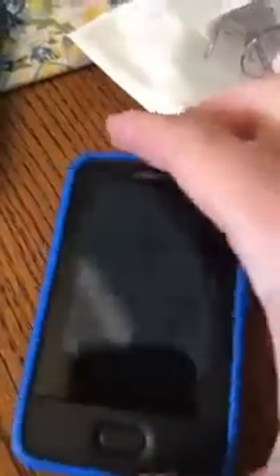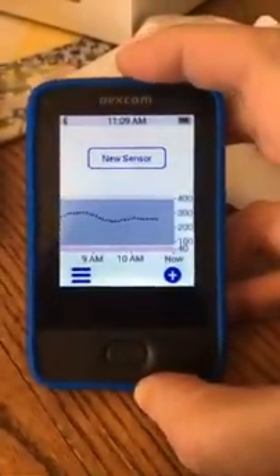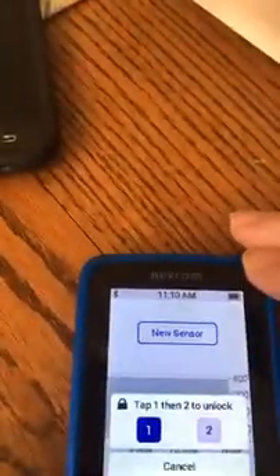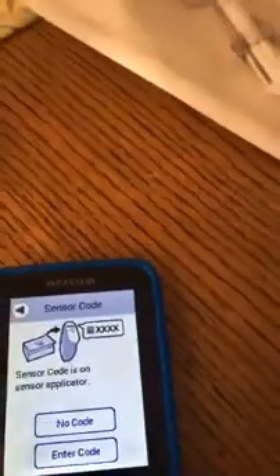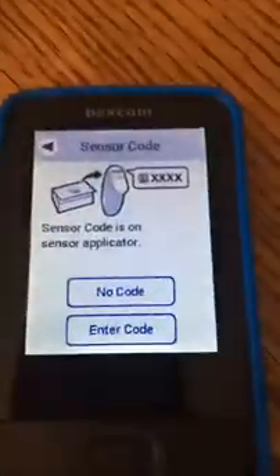I've taken off her sensor because it gave me an alert, and it actually doesn't leave much of a scar. Our receiver looks like a little phone. You can see it says 'new sensor.' I'm going to press new sensor and then I have to unlock this. The way this works is on the bottom here is the sensor code, and that is what we plug in here.